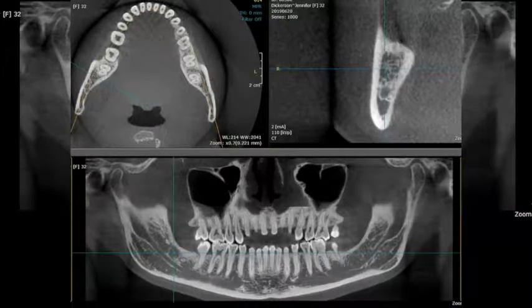Now, these are not even true Hounsfield units, even though we call it cone beam CT. It's not even CT. I'll give you one principle. We get cubes of data in a cone beam scan. We don't get pixel data until we display it. We get voxel data. We get little tiny cubes, about 1/10 of a millimeter in size. A true conventional CT scan gets every point of every piece of tissue in the patient's body in the scan. That's why the dose is so high. That's why you've got a gantry going around you.